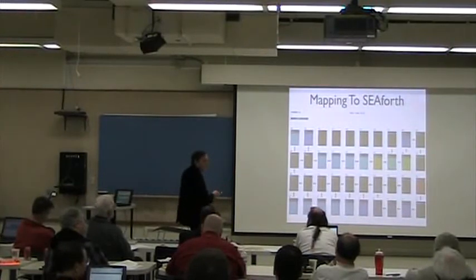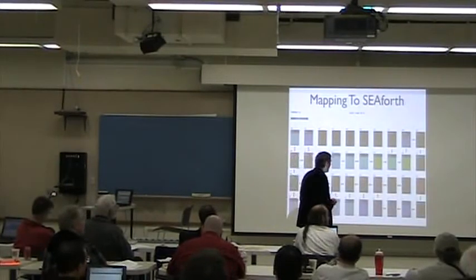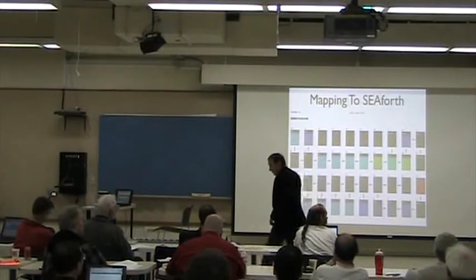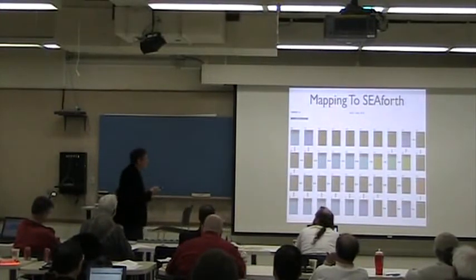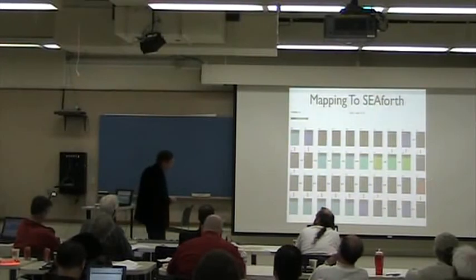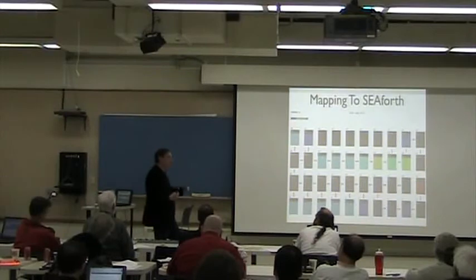And why is the input block so much more busy than the output? Well, because this is a simulation, and during the simulation we were reading from a file, and the test bed was done just this way. So we just do constant polling. When it's ready, we kick it out.